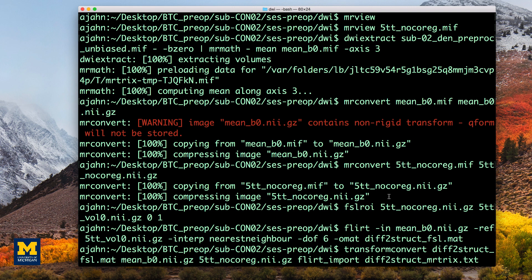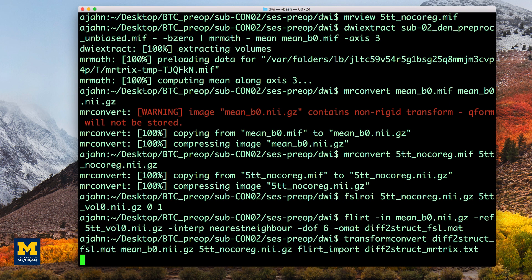This command takes the transformation matrix we just created using FSL and then does the co-registration between the B0 and the 5tt_nocoreg images to generate a transformation matrix that can be read by MRTRIX, and we'll call the output diff_to_struct_mrtrix.txt.